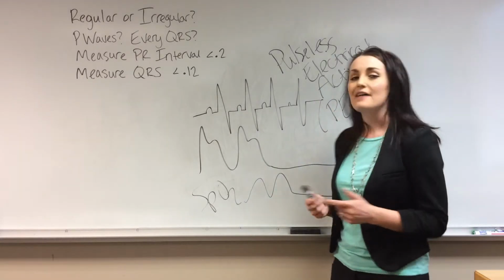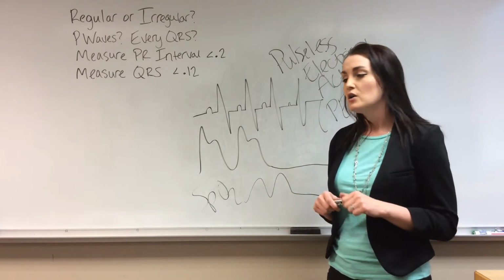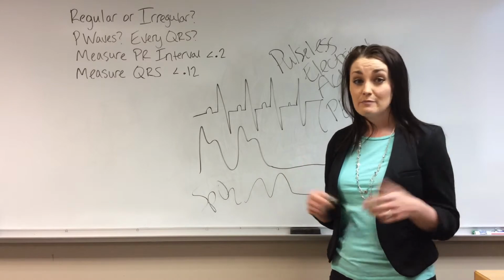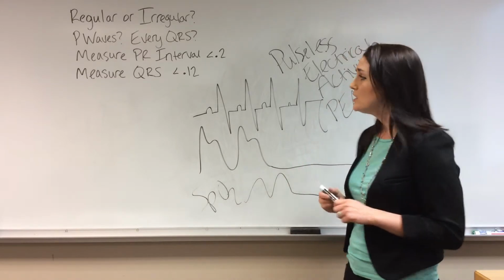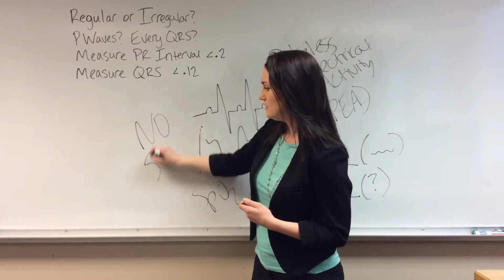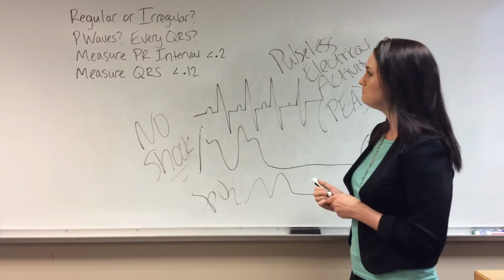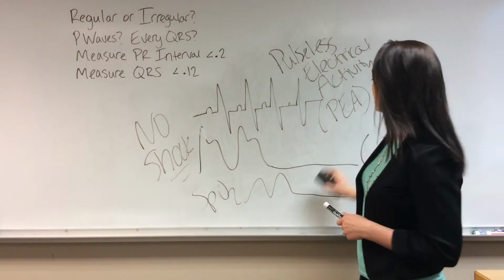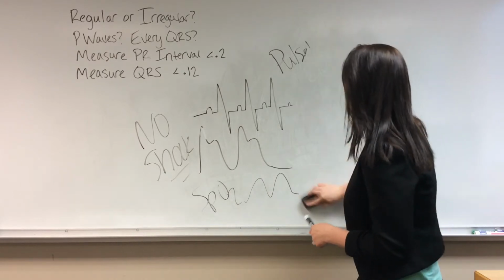So with this, obviously there's no pulse, so it's a code situation. We do CPR, we give epinephrine, give meds, intubate, do that whole thing. There's no shock with pulseless electrical activity. So yes, that is PEA.